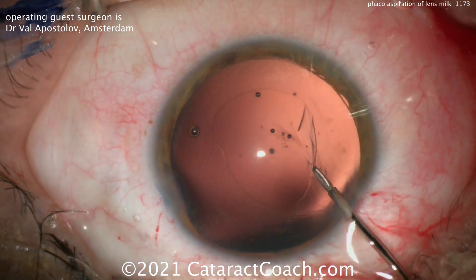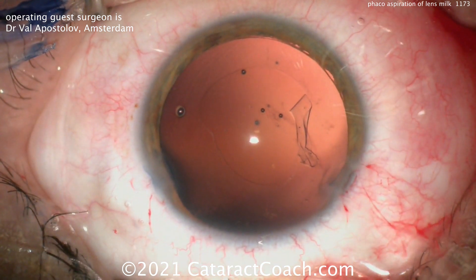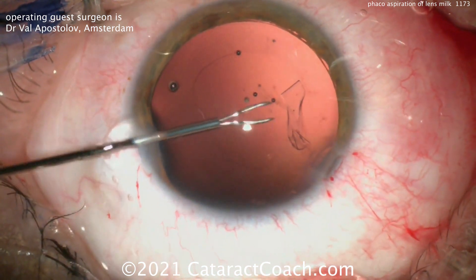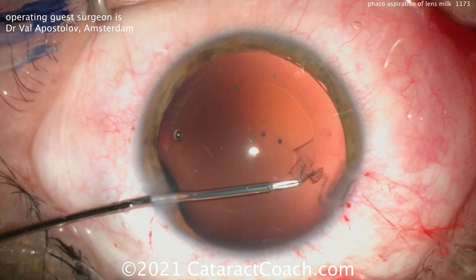Dr. Apostlav is a very talented surgeon and he can still make a beautiful rexis even without the IOL in the bag. Look at that hand switching — this really hammers home the point: if you're a young resident or doctor in training watching this, you've really got to be able to use both hands.